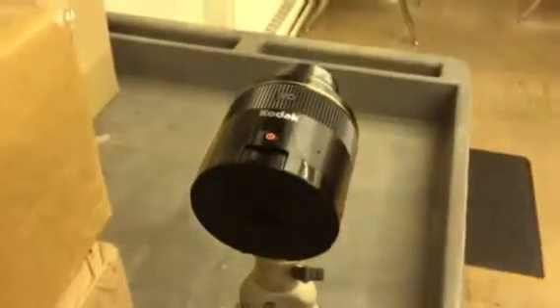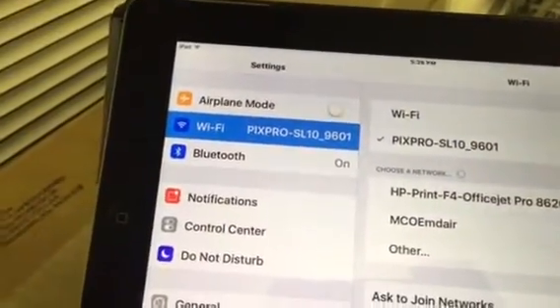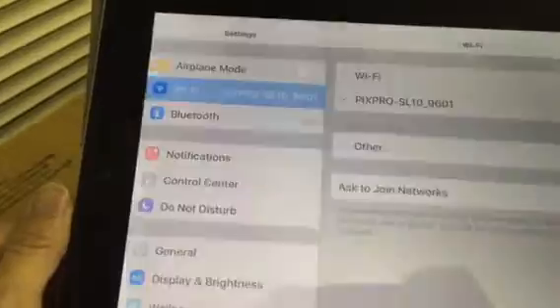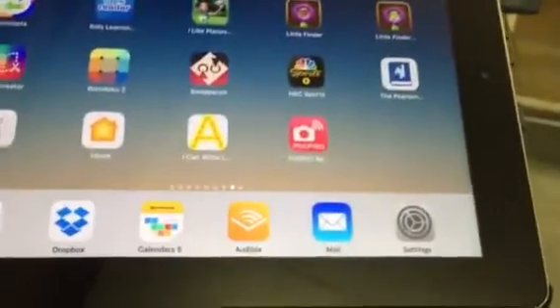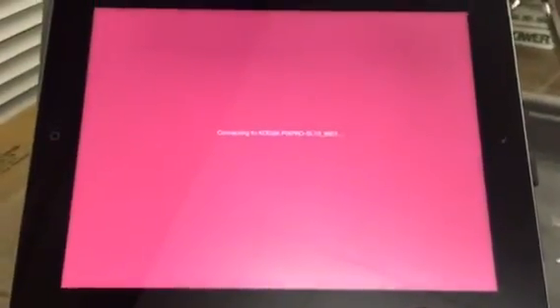You turn on your smart lens and it creates a Wi-Fi signal that you connect your device to. I'm already hooked up here. Kodak has its app for this particular camera called PixPro. If I open that up, it connects to the camera and what we're looking at is the view through the camera now.